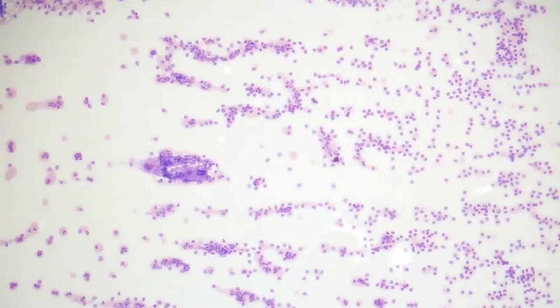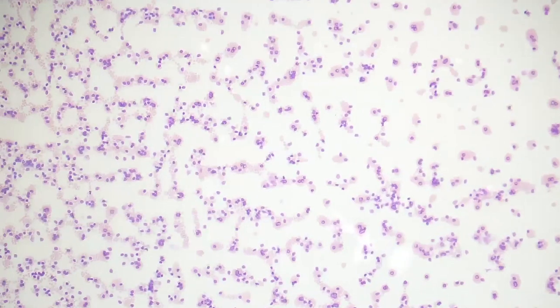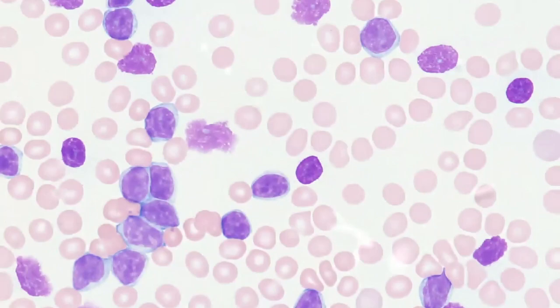Here's a peripheral blood morphology smear from a patient with CLL, or chronic lymphocytic leukemia. Here at the feathered edge, we see that there are innumerable mononucleated, likely lymphocytes. And as we find our zonal morphology, there are some morphologic clues to indicate that this is chronic lymphocytic leukemia and not some other hematologic malignancy. You'll notice also the cytoplasm is relatively scant with a high nuclear to cytoplasmic ratio.